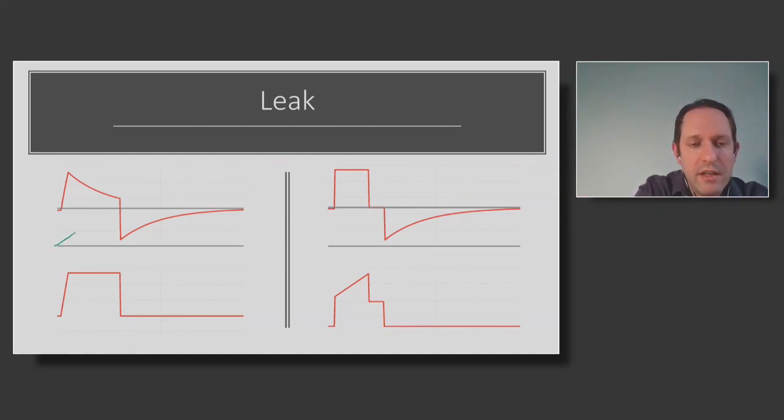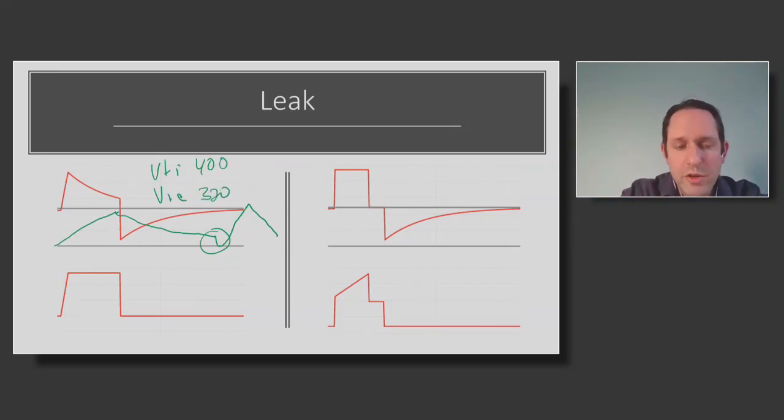So again, just like you would see with a pneumothorax, volume would go in when the flow is delivered, and then volume would come out, but then it would be interrupted. And then the next breath would give the volume and it would come out. So this tells you that, again, there's a leak. Your VT inspiratory, your VT expiratory, you're going to have a discrepancy here. So you want to make sure that if you can't find the leak, the leak is not a pneumothorax.